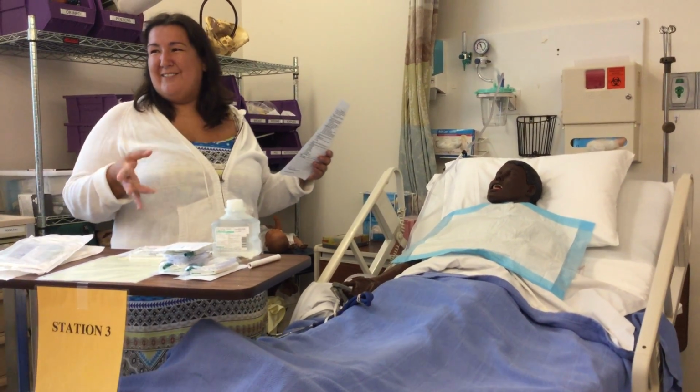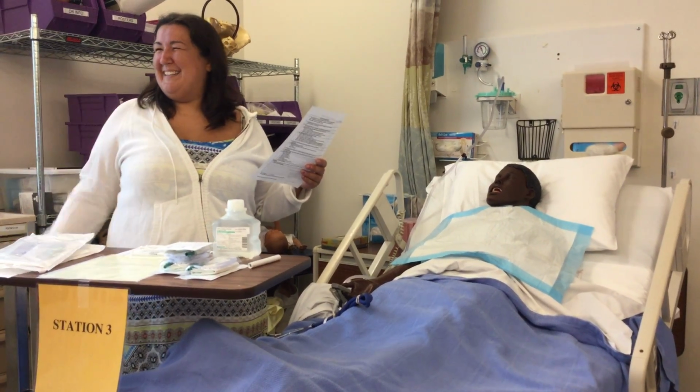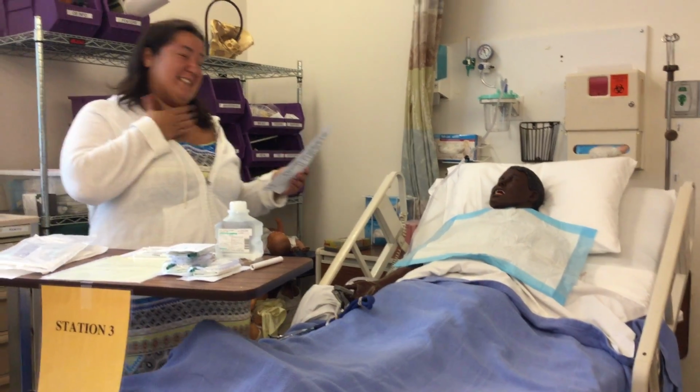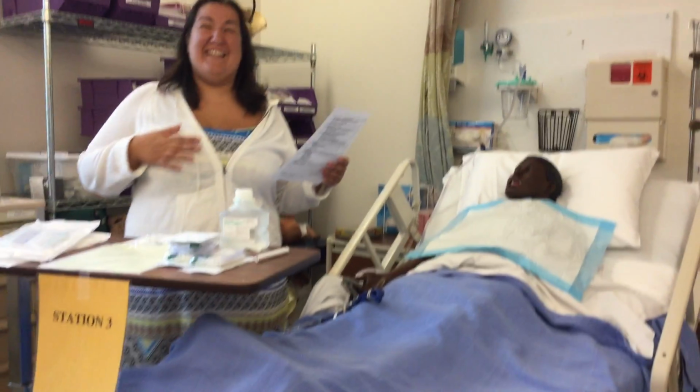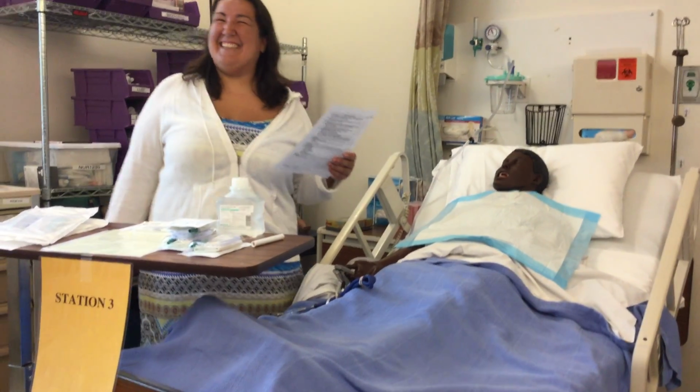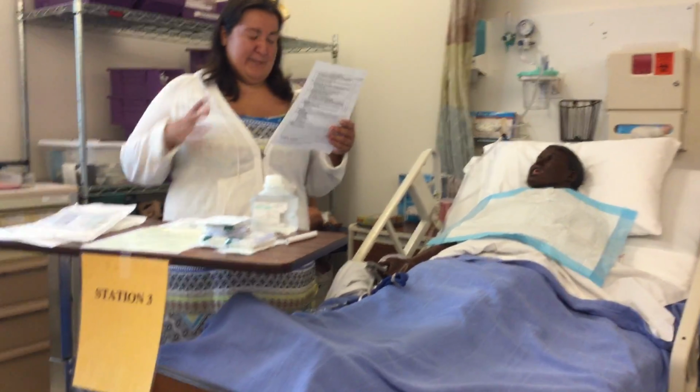Lots of times I would put on a gown when I did because I didn't want to pick it off of my scrubs, which they will, especially with trachs. Not so much with nasal or oral, but with trachs, they start coughing, and guess where it goes? That's the only time I ever got it. Yes, yes. So when we do trachs, especially, you really want it.